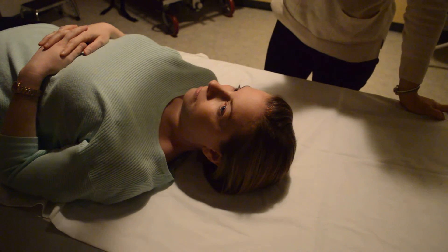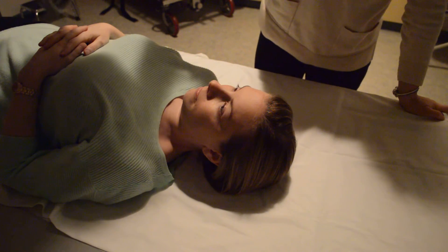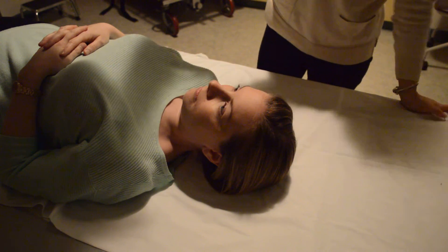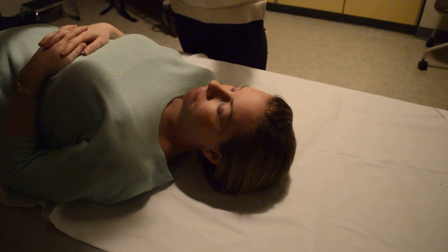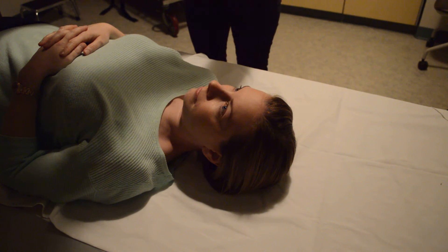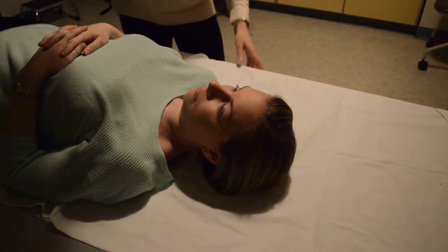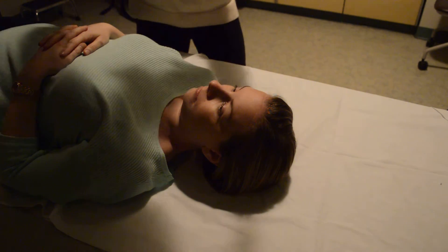So, you are going to have to adjust your SID to the 30-degree line. I'm going to go 30 degrees caudal and go ahead and move my tube.